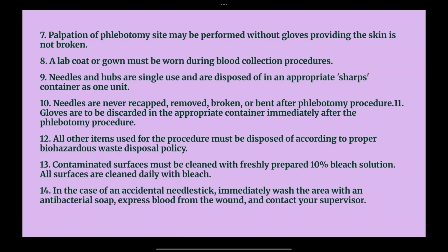So there is color coding for each disposable item that you use in the medical field. For needles and other sharps, it is usually a white container, which is a puncture proof container. The needles are never recapped. They should never be recapped, never be removed with hand, never be broken or bent after the procedure is performed.